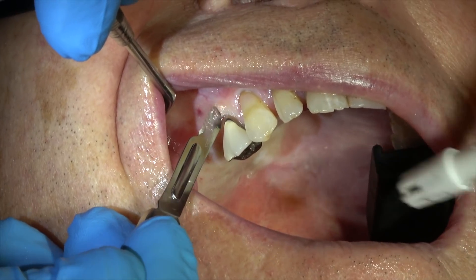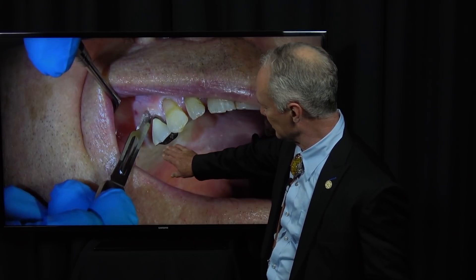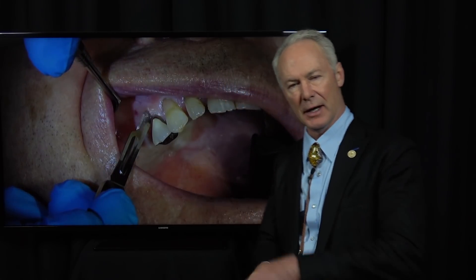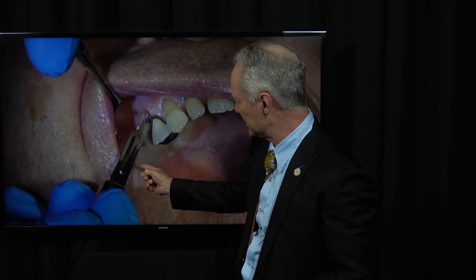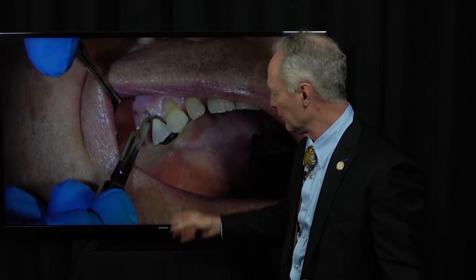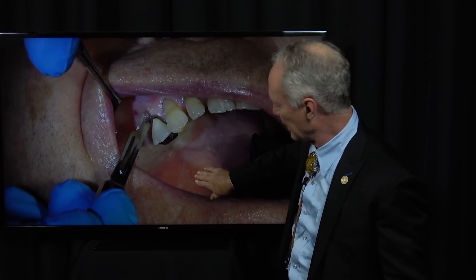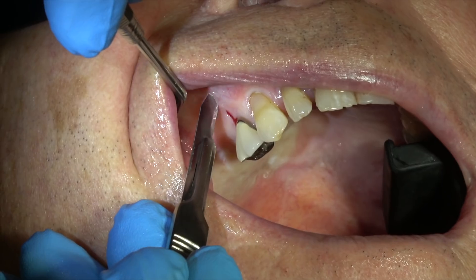You always want to make the mesial-distal aspect of the incision toward the palatal so you can reflect the tissue to the buccal and then retract it. You don't want to ever make the mesial-distal incision down the center of where the implant will be, because then you have to reflect two flaps. You only want to reflect one flap so you can hold that flap while you place the implant. You don't want to be retracting a flap to the palatal.